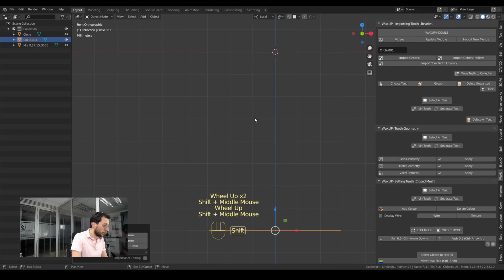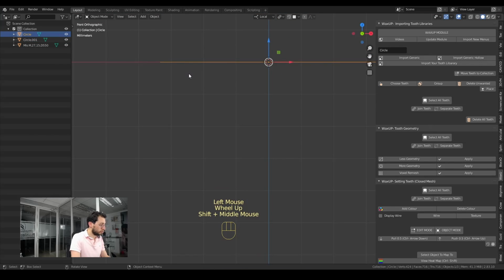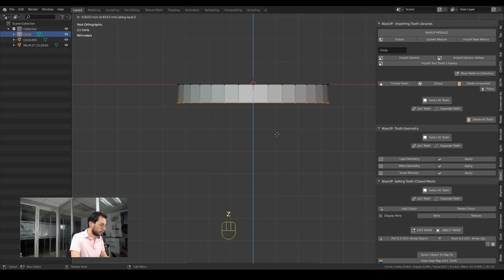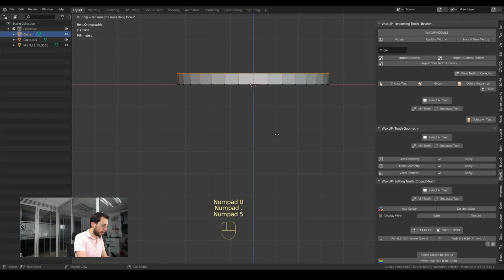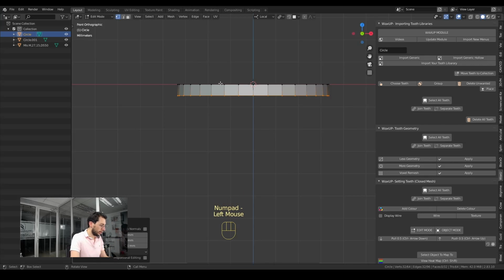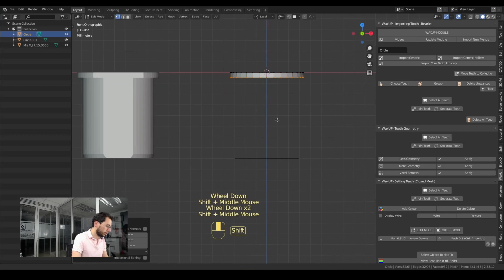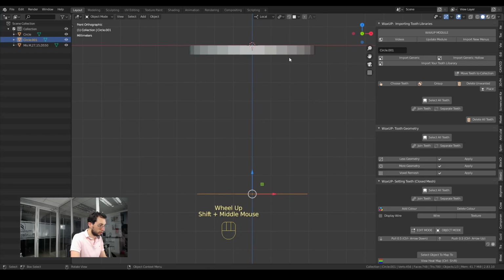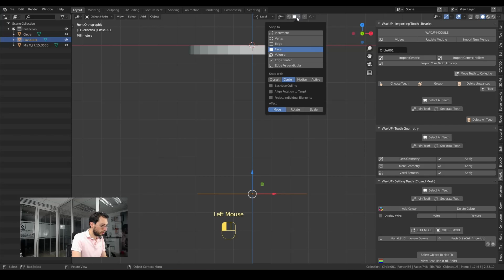So since I already know that dimension, what I have to do is to create a small cylinder with 0.5 millimeters in height. In order to do it, I go here to edit mode in the upper circle, then press E and Z to move it only in the Z axis, and then I press 0.5 minus to make it go in the minus direction downward, okay? And then I will do the same thing with the upper circle, but since I need it to be flush with the step, with the upper part, what I'm going to do is to use the magnet tool or the snapping option.